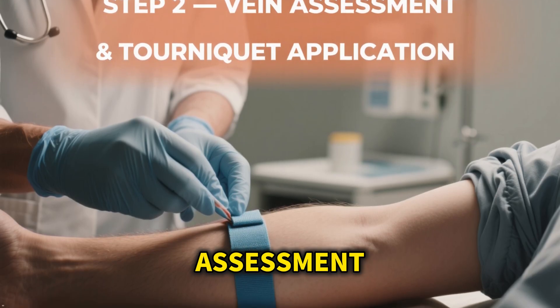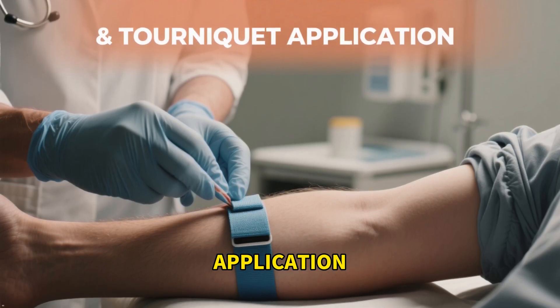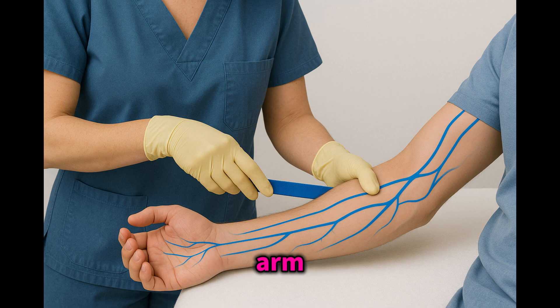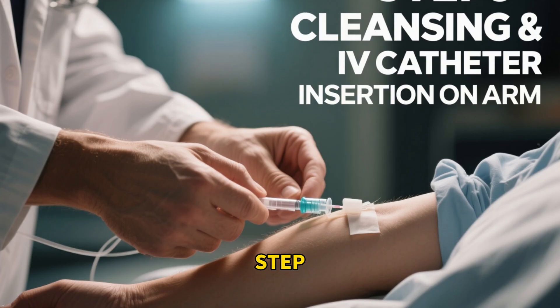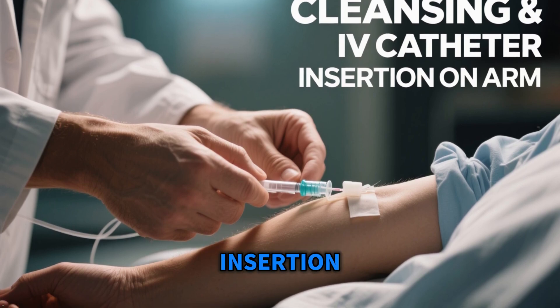Step 2: Vein Assessment and Tourniquet Application. Apply the tourniquet 3 to 4 inches above your insertion point. Look for a vein that is straight and palpable — soft and stays visible when the tourniquet is on — commonly found along the forearm, the cephalic or basilic vein. Ask the patient to clench their fist, or use a warm pack for 1 to 2 minutes to dilate the veins. Release the tourniquet briefly to allow blood refill, then reapply to maximize visibility.